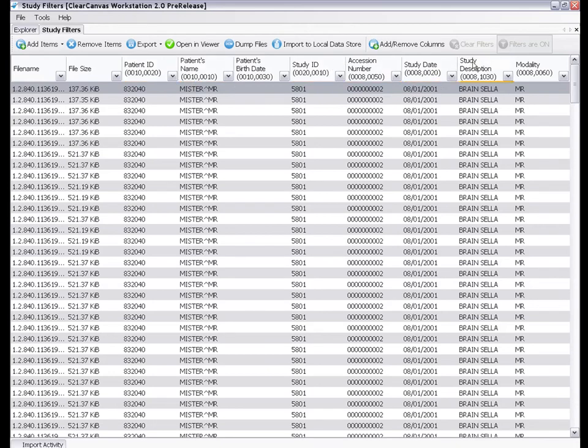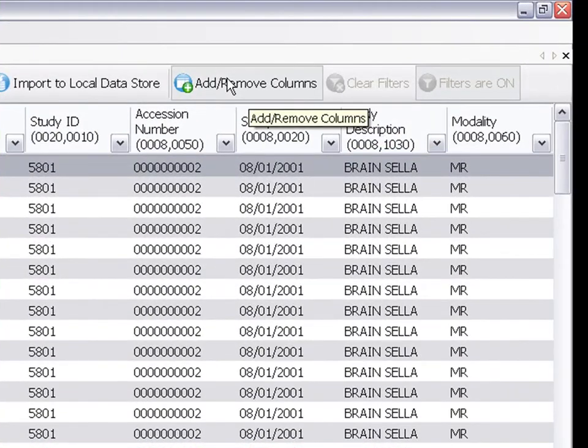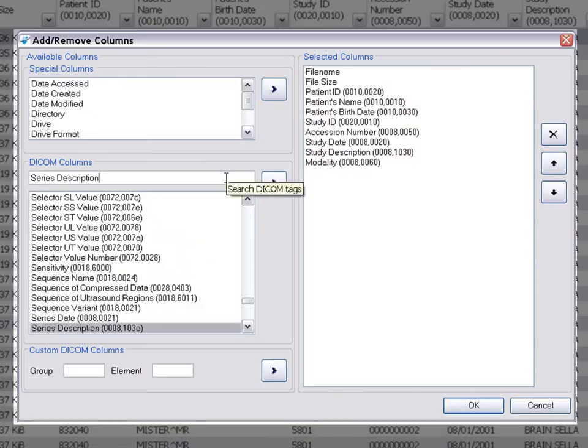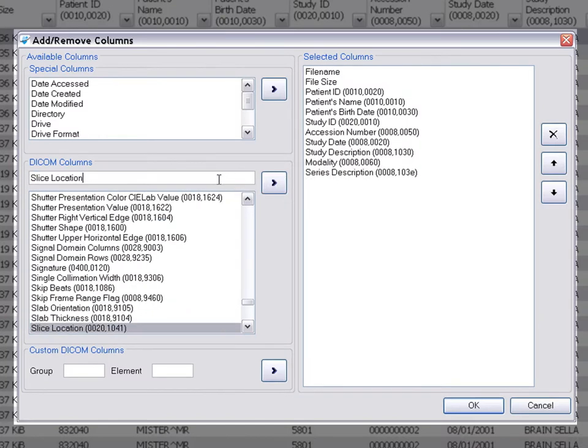Let's say that I want to find a range of slices within a certain series of images. In order to do this, I would click on Add Remove Columns, add the series description, and add the slice location.